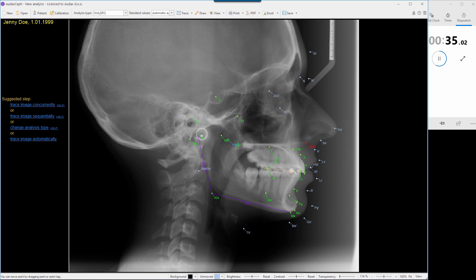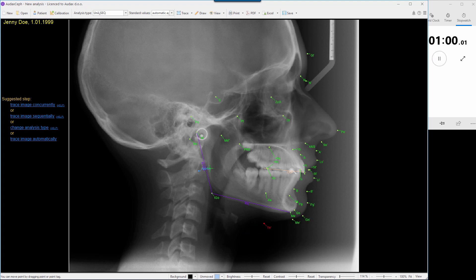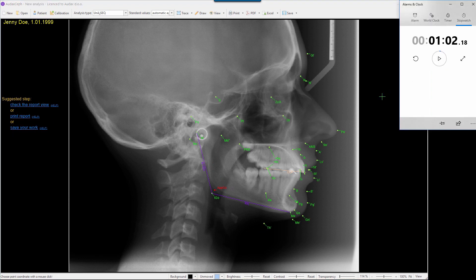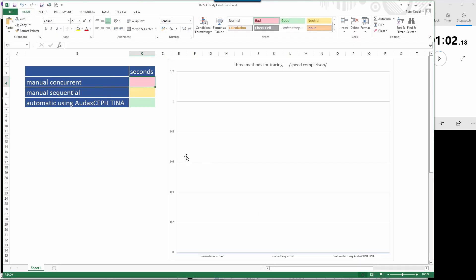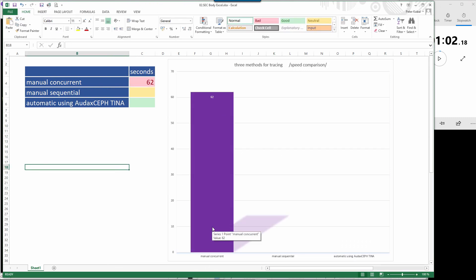Points change color to indicate which point has been moved. Point A here, anterior nasal spine, posterior nasal spine, orbitale, zygomatic orbit ridge, nasion, glabella, pronasale. I need to take care of soft tissue. Point B, pogonion, nasion, menton — and this point should be here. And I am done. I have 62 seconds and I will enter 62 seconds in the Excel graph indicating 62 seconds.